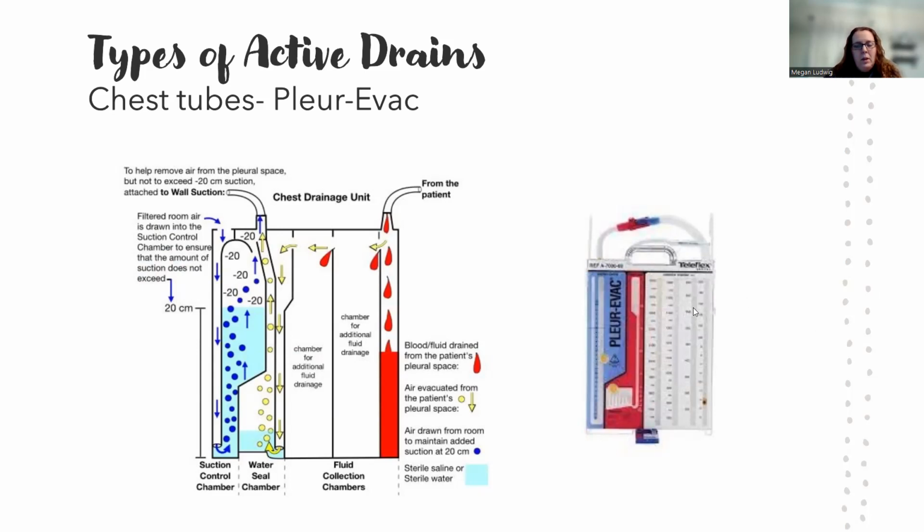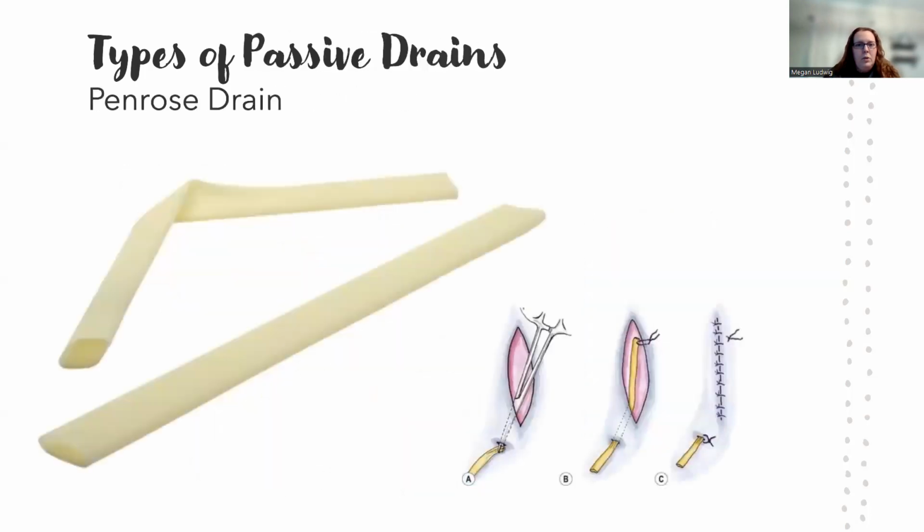So be very careful. And when you're moving a patient, you want it to be lower than the chest level to allow it to drain down. You don't want it to be up higher, or there's no drainage. That's going to happen. That's true of any drain. All right, so those were active drains. Something was actively drawing the fluid out.